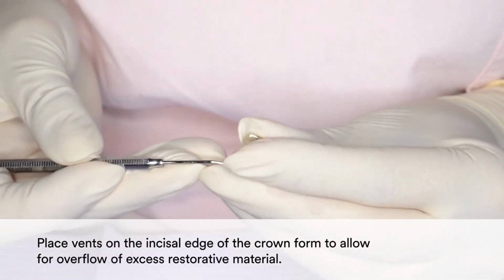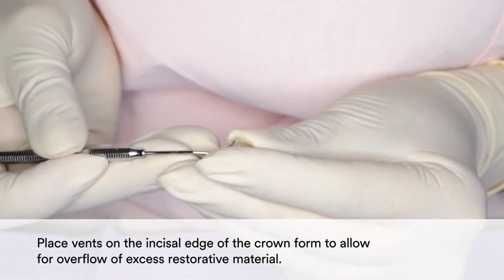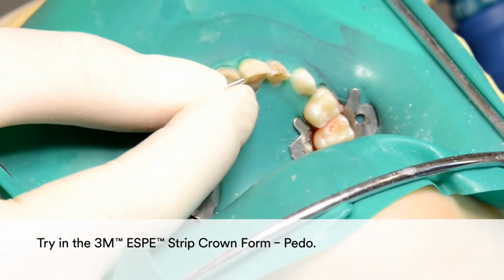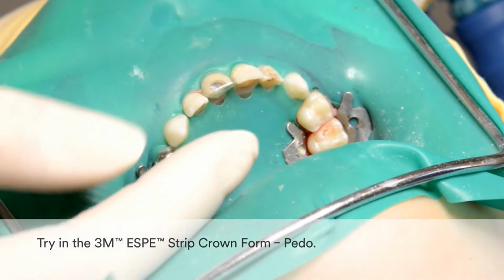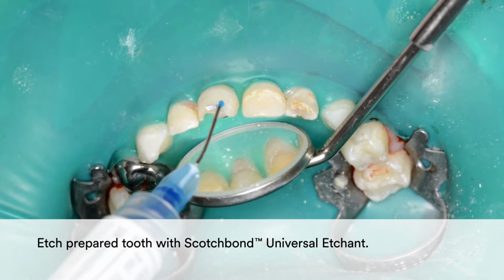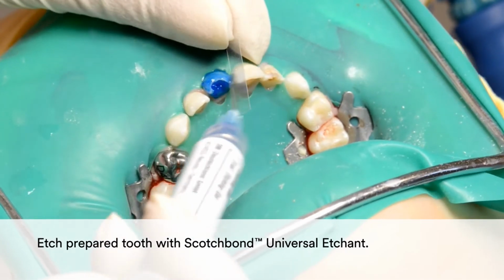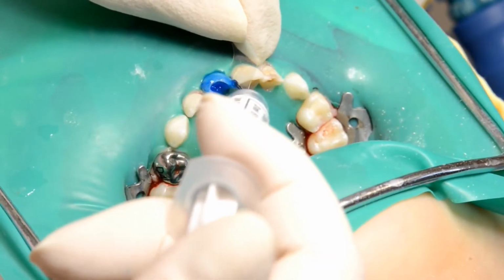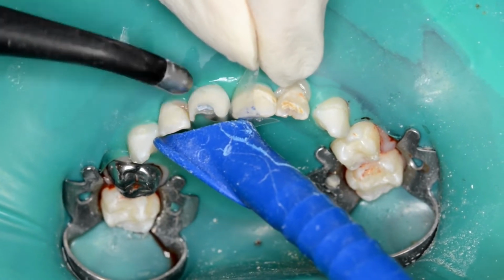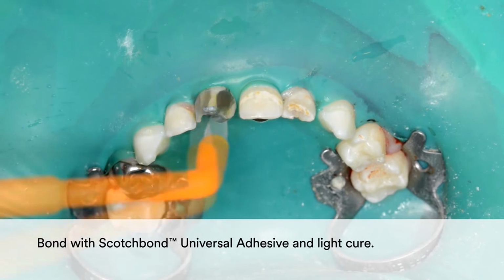You may place vents on the incisal edge of the crown form to allow for overflow of excess restorative material. Then, try in the 3M strip crown form. Etch the prepared tooth with Scotchbond Universal Etchant. Bond with Scotchbond Universal Adhesive and light cure.